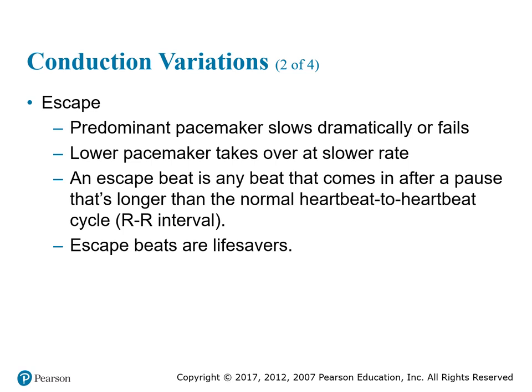Escapes occur when the predominant pacemaker slows drastically or fails completely, and a lower pacemaker takes over at its inherent rate, providing a new rhythm that is slower than the previous rhythm. An escape beat is any beat that comes in after a pause that's longer than the normal heartbeat-to-heartbeat cycle, or R to R interval. Escape beats are lifesavers. An escape rhythm is a series of escape beats.